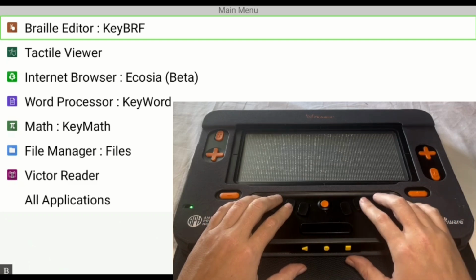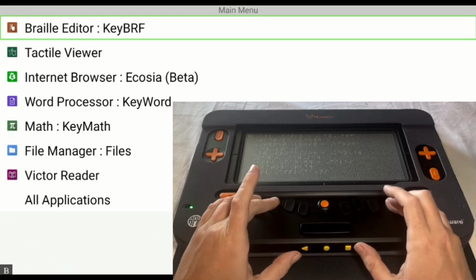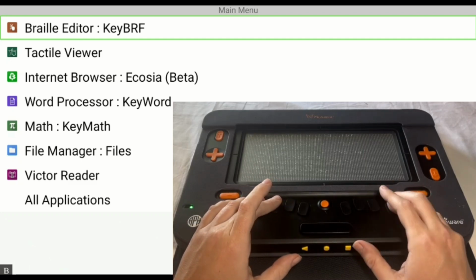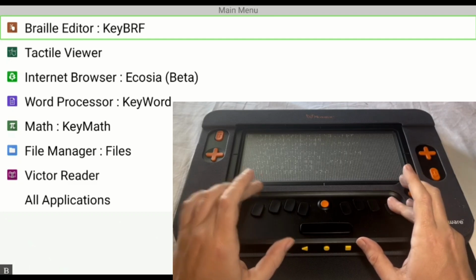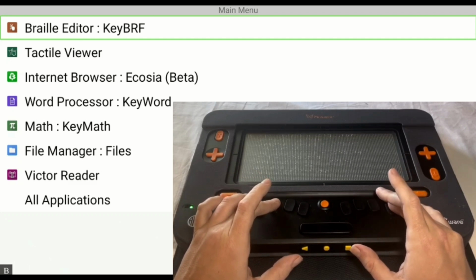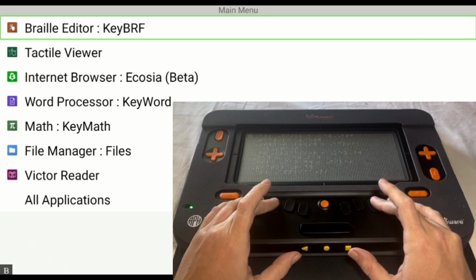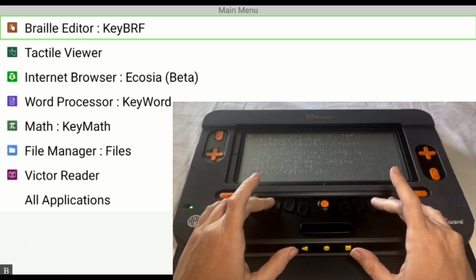So with these same commands, I can hold Enter and .5 to increase. Louder. And Enter and .2 to decrease. Speech rate 35%. So if I wanted to adjust my speech rate, you hold Enter and .6 or Enter and .3. Enter and .6 moves it up faster, and Enter and .3 moves it slower. So it's the same idea as these other buttons, but for speech rate.